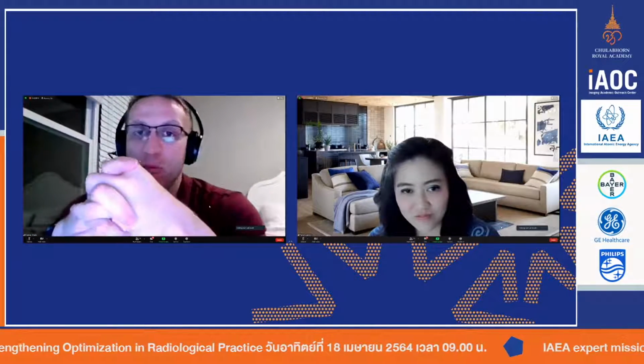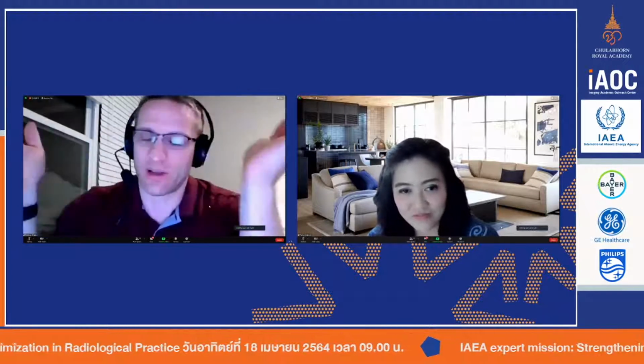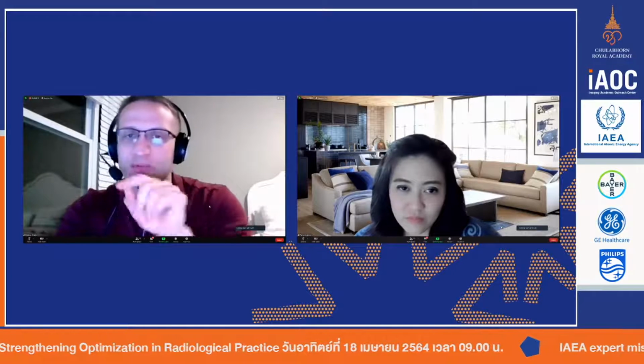So I'm going to tell you a little dirty secret. There are some systems that you buy that have a continuous button. Very specifically, there's one vendor, one mobile C-arm. I have no issues. It's GE. Actually, it's OEC, but GE owns OEC, so it's basically a GE system. If you buy their system and look at their little control unit, there's a button that says continuous and one that says pulsed.